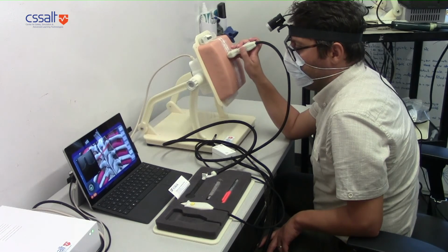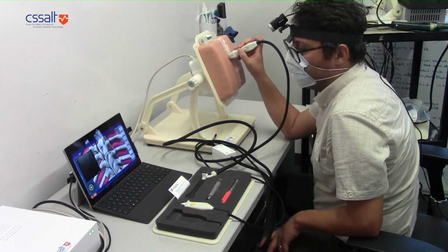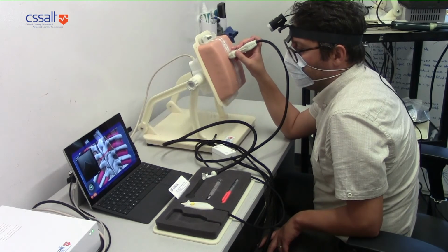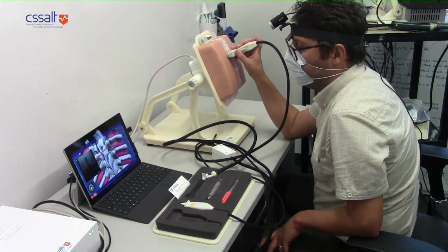Yes. Shall I put it to 3 or 9? 9. All right. And the reason you put it at 9, if you look at the ultrasound image, do you see there's a dot on the ultrasound image? Can you point to that, Dave, with your cursor? Yeah. So that dot now corresponds to the dot on your probe, and your probe is at 9 o'clock because the ridge is also to the left. So now you're centered on the spinous process.